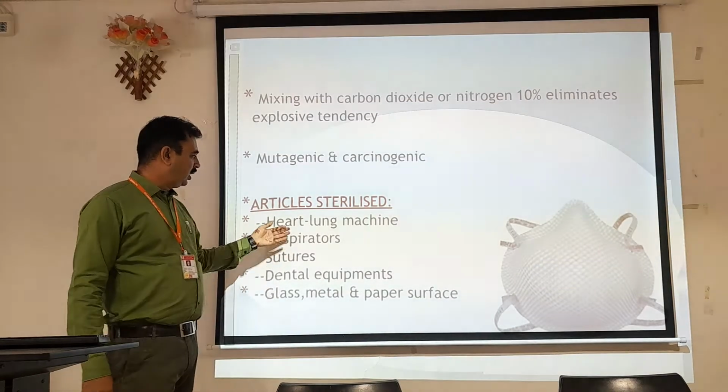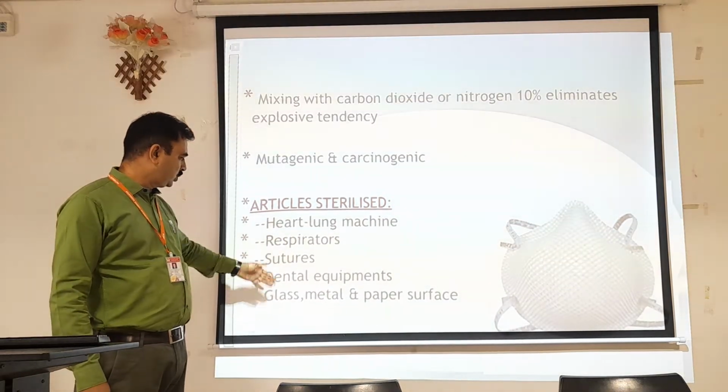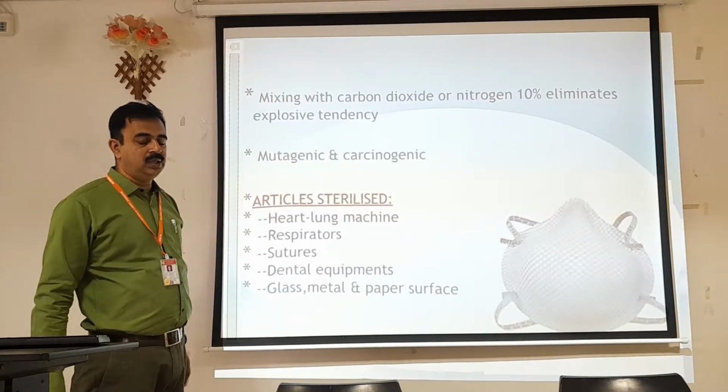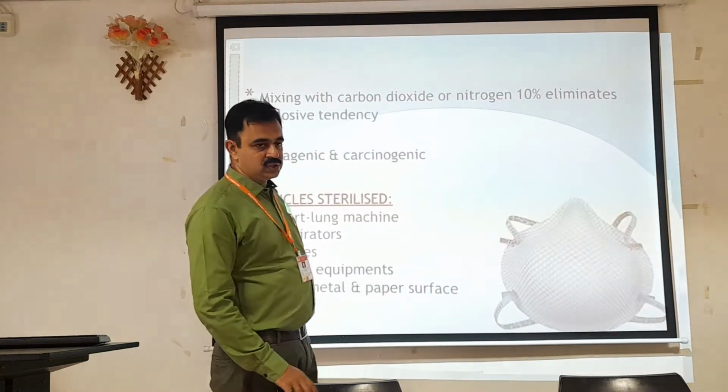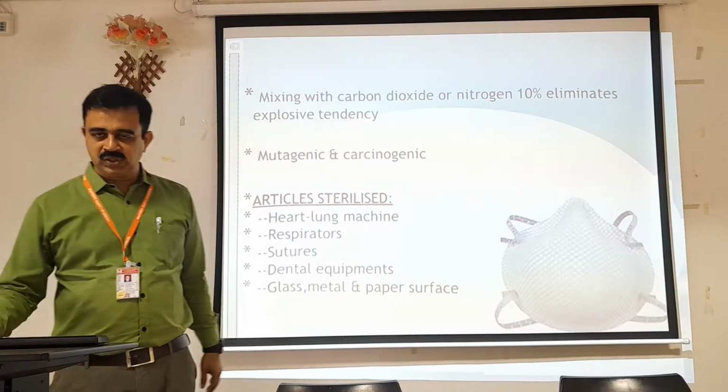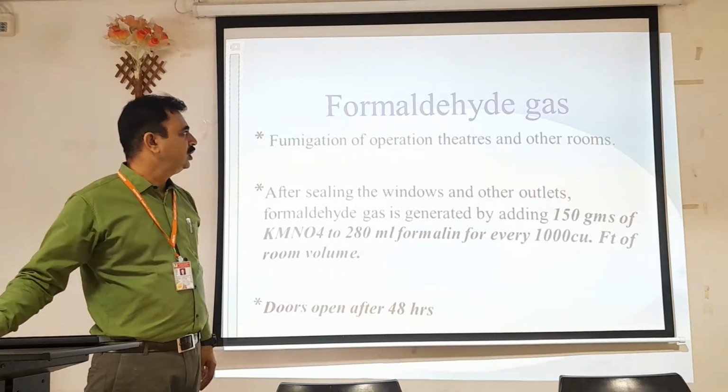Articles like heart-lung machines, respirators, sutures, dental equipment, glasses, metals and paper surfaces can be sterilized with the help of ethylene oxide gas. So this is the way by which gas sterilization takes place.